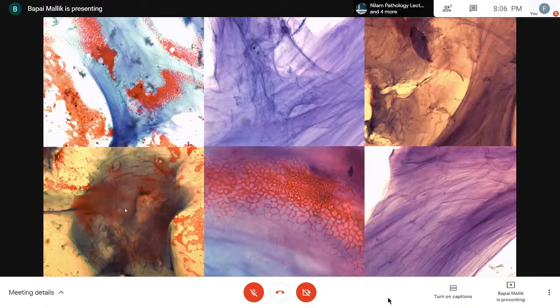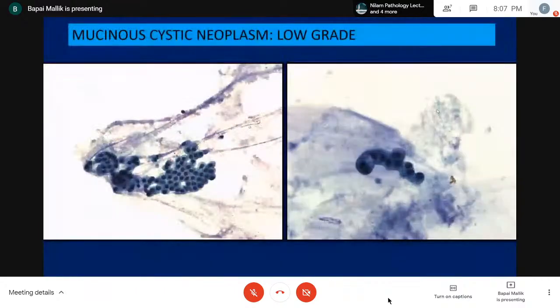This is a collage. I couldn't help putting this up of mucin, and it looks pretty stunning from various angles, very thick mucin. You can see this kind of strands like paintbrushes. They also trap RBCs in very spectacular ways. So this is all the stuff where you can be pretty certain that you're dealing with mucin and nothing else, and this is very vital.